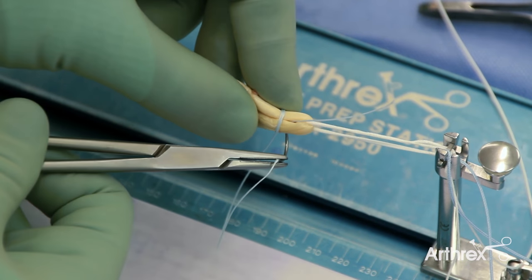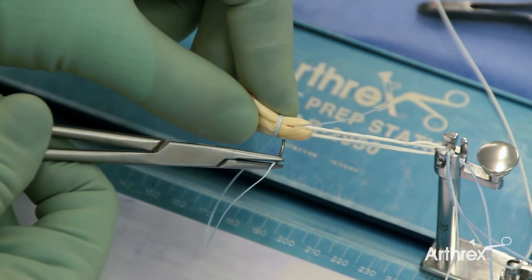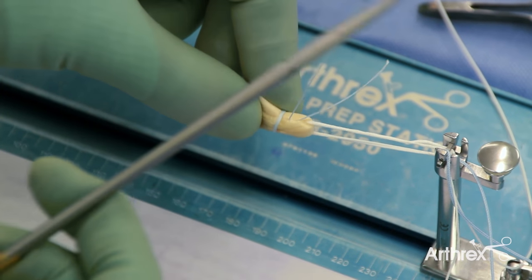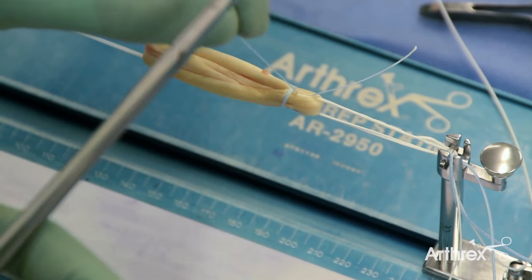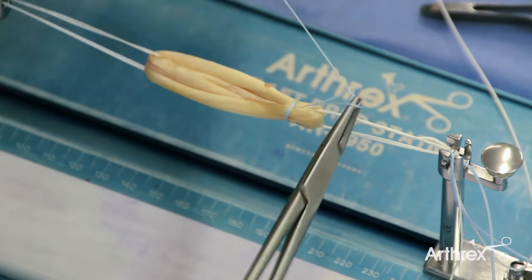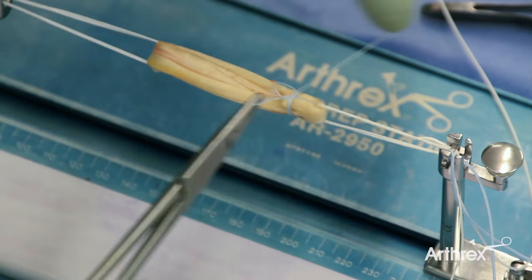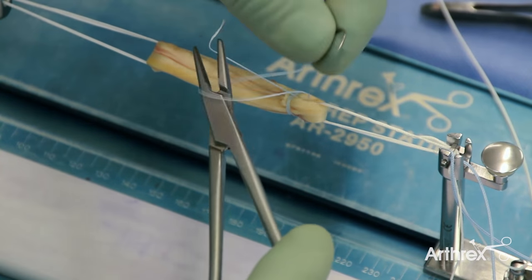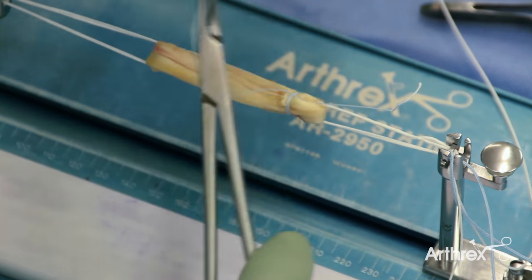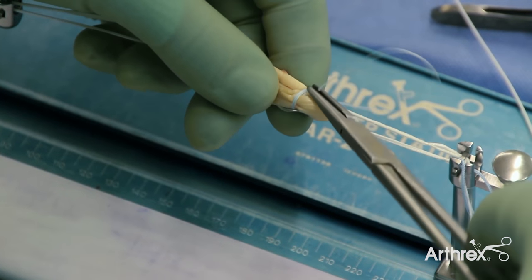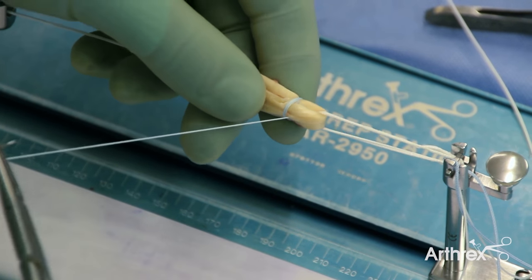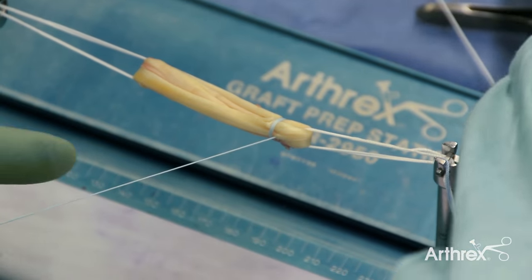The needle is then brought back through the center of the graft and is tied in the standard way. To bury the knot, we then cut the short end and take the needle out through the graft link to bury the knot.